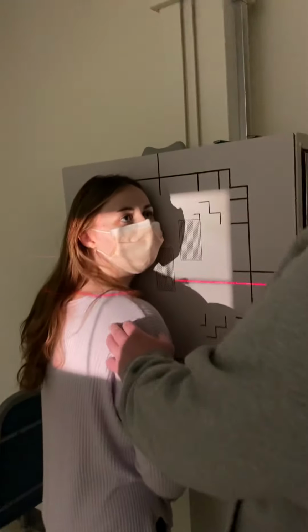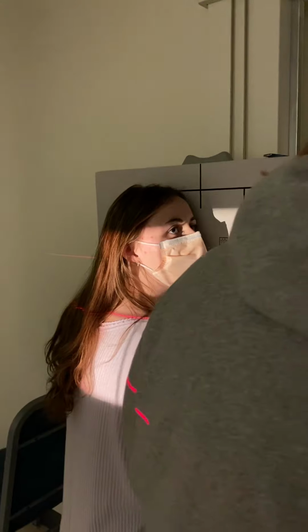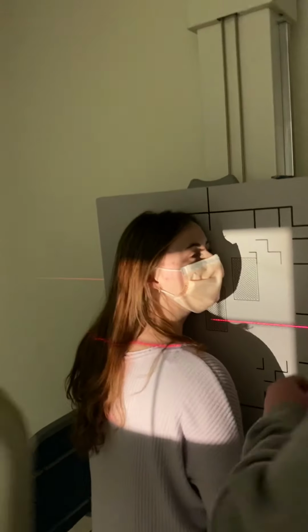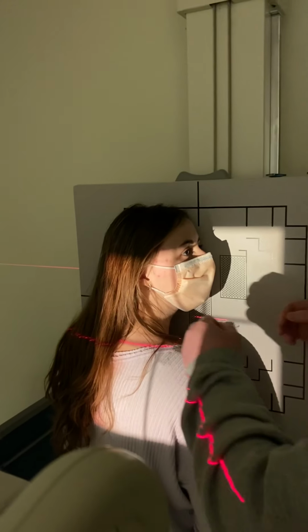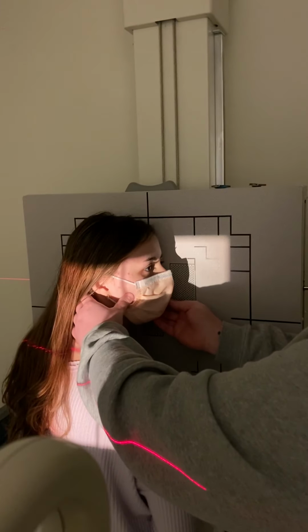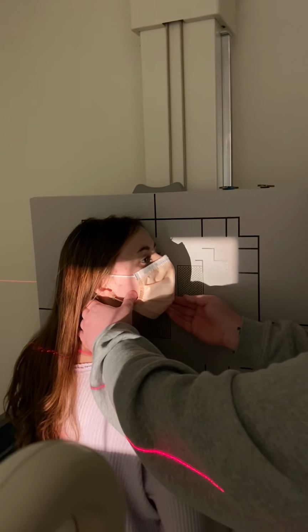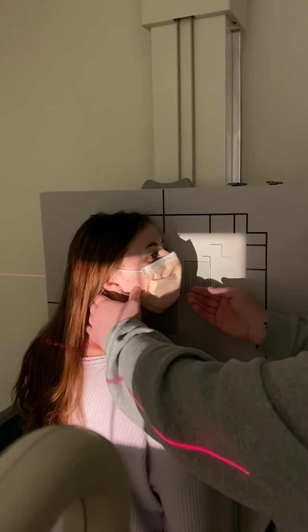With the lateral projection of the orbits, I'm going to have Bailey oblique her body and put her head in a lateral position. So I would just tell her, kind of move your body against this board right here and turn your head to the side. I'm going to make sure her IPL is perpendicular to the image receptor and that her IOML is running parallel to the image receptor.